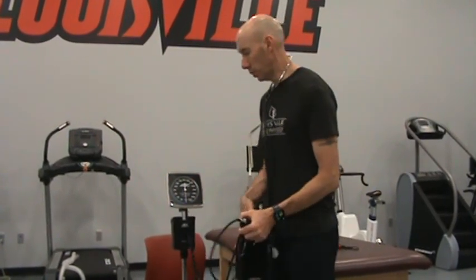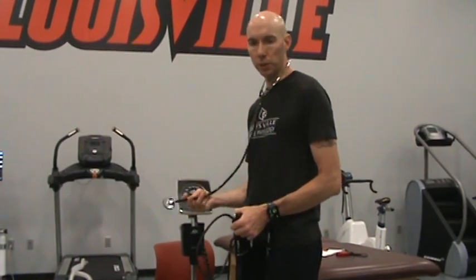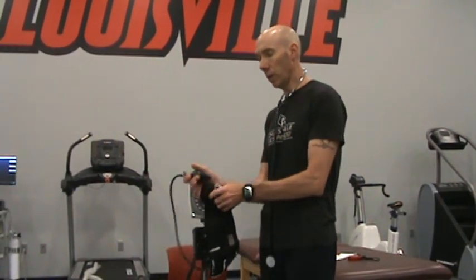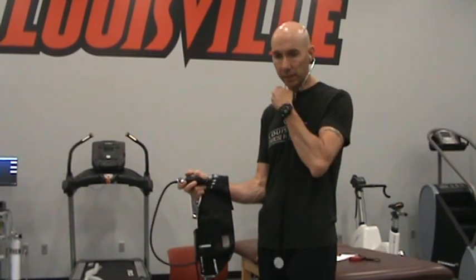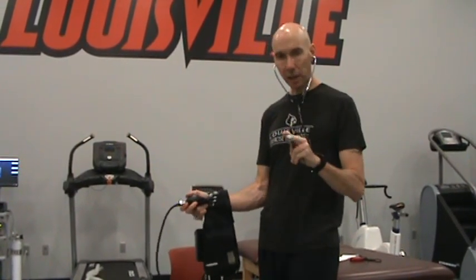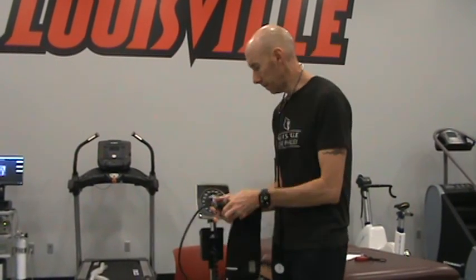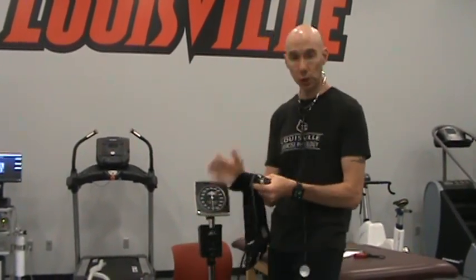Now, we haven't shown what we do with the stethoscope yet. I'll just show that when we do the assessment on our subject. But what I would do is, once I get the cuff placed, before I pump up, I would then put the stethoscope in, have this in my left hand, pump with my right hand. Okay, so that's kind of the crash course in blood pressure.